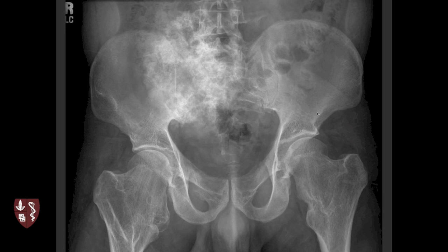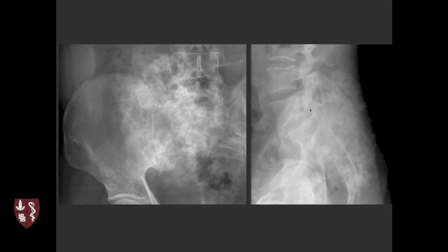Here's one that was bad, though. AP pelvis on a young man in his early 20s with hereditary exostosis, manifested by big broad-based sessile osteochondromas along the femoral necks. The problem is a big fluffy mass lesion around the right SI joint visible better on the lateral view — a big exophytic mass with chondroid matrix. Whenever anything gets this big, ill-defined, and extending outside the bone, you definitely have to worry about malignancy. This was in fact chondrosarcoma — malignant degeneration arising in the region of the right ilium or sacrum.